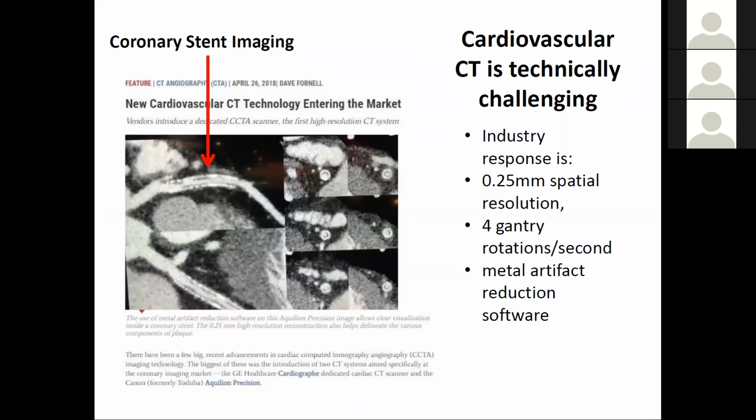Well, the way metal artifact works is there are two things: metal artifact per se and what's called starvation artifact, so just the total amount of attenuation. The biggest source of artifact for that is when you have two pieces of metal in the field of view. Then it really kills the line of response. It starves it down to nothing. But one place where dual energy can be useful is to be resistant against the metal artifact. The metal artifact correction algorithms do things like taking your sinogram, and it'll have a hole in it because where the metal was, there's starvation. Or it will have the wrong CT value because the Z of the metal is way different than water.